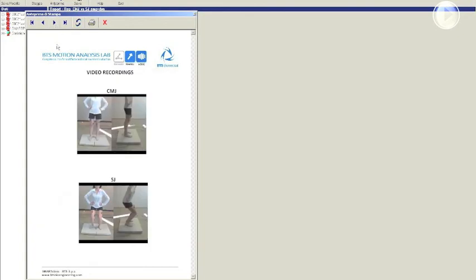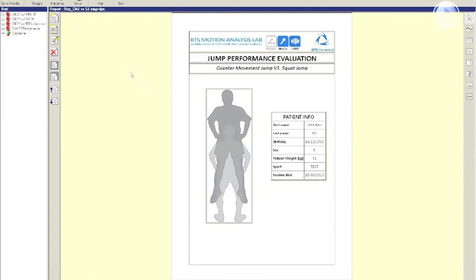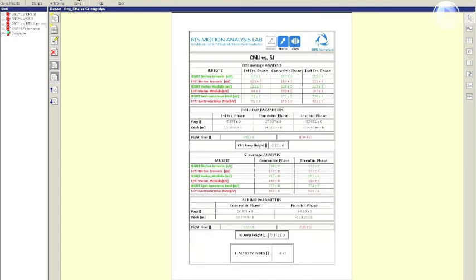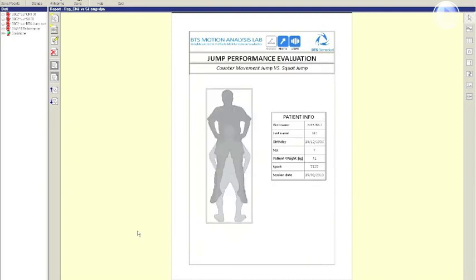In the last page, as usual, we record the video and we show the video. Of course, this video can be visible if we save the HTML file. They are going to be a single frame if we print the PDF. Of course, once we close the preview, we can scroll all the pages. You can see here what we saw before. And this is the result of the jump performance evaluation.